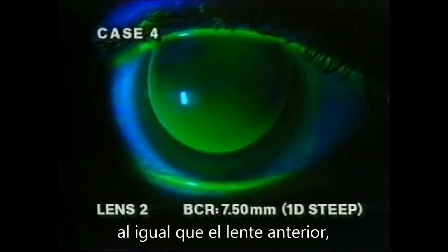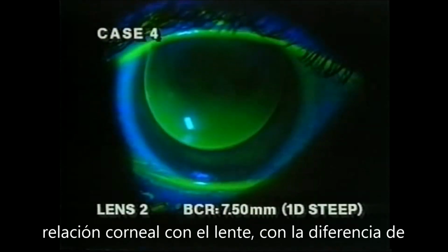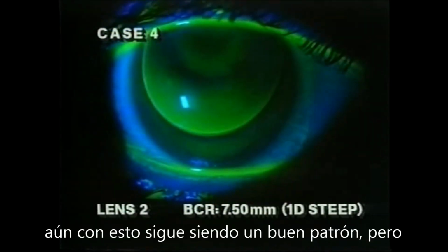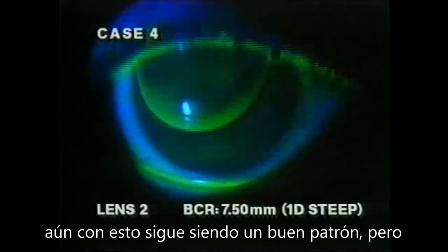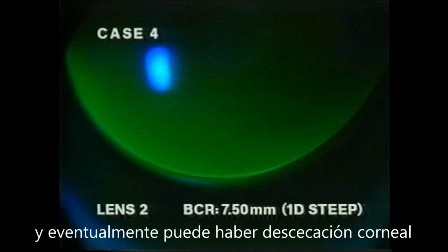As with the previous lens, fluorescein evaluation reveals a less than ideal fitting relationship, with perhaps a slightly reduced bearing area. The dumbbell appearance is still quite apparent. The excessive inferior edge clearance due to absence of corneal alignment may eventually result in corneal desiccation.